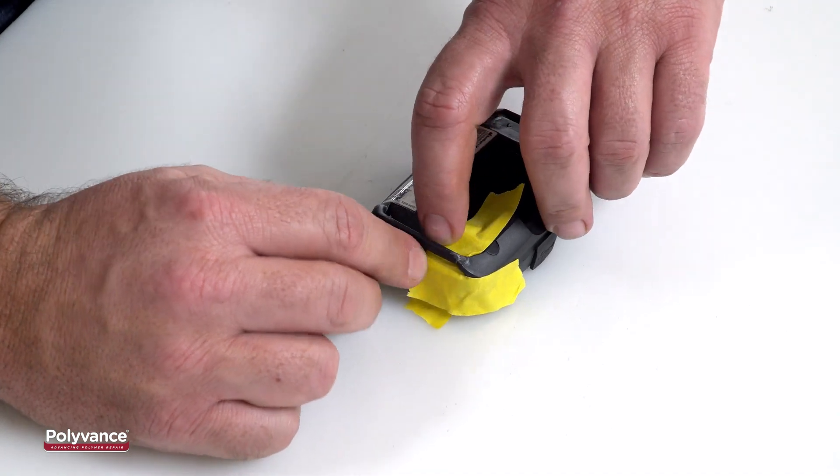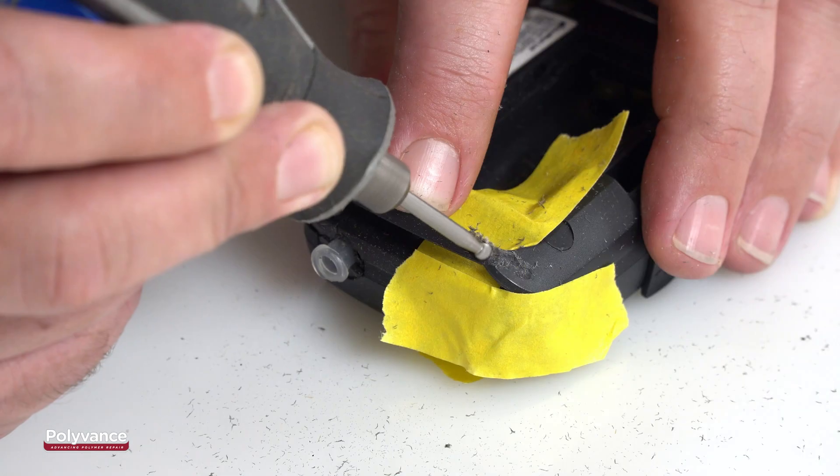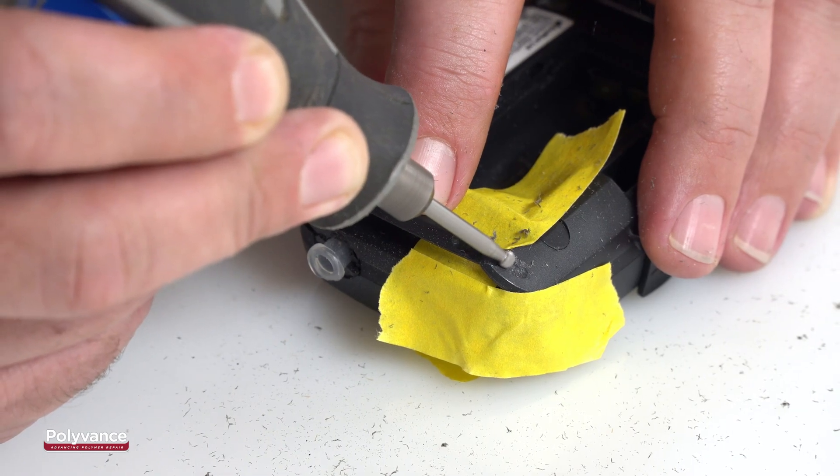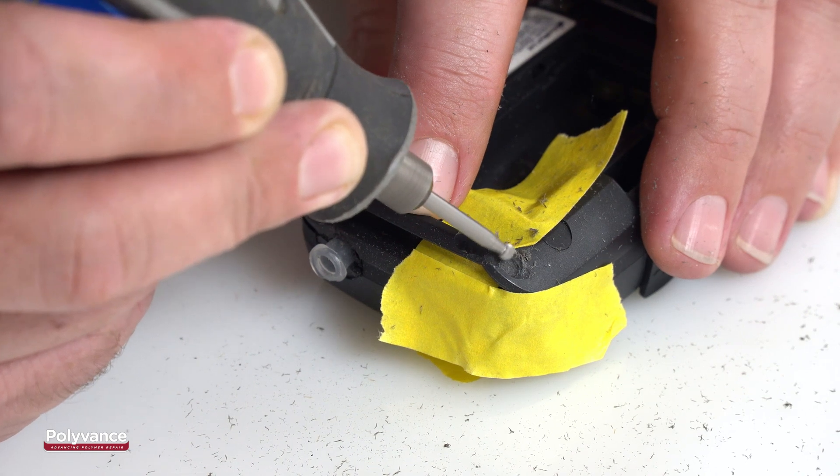Again, apply tape to protect areas you don't want the PlastiFix to adhere to. V-groove across the crack about halfway through the plastic so the PlastiFix can support the area after it's been sanded smooth.